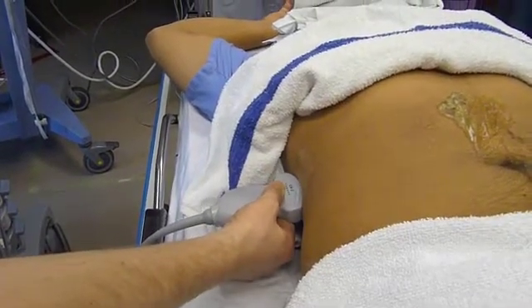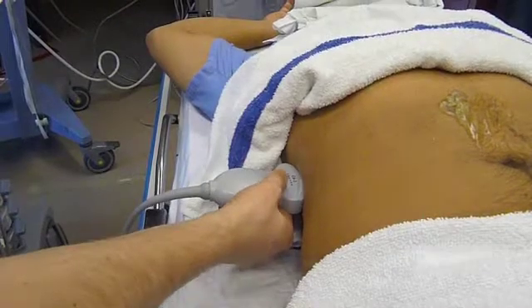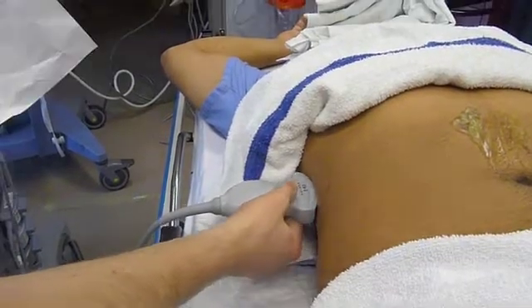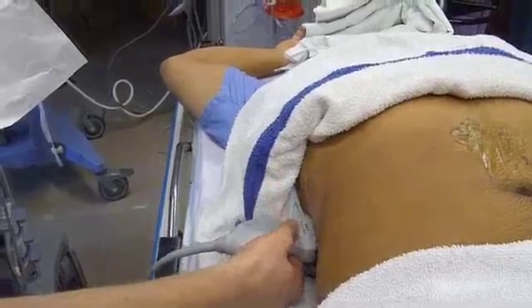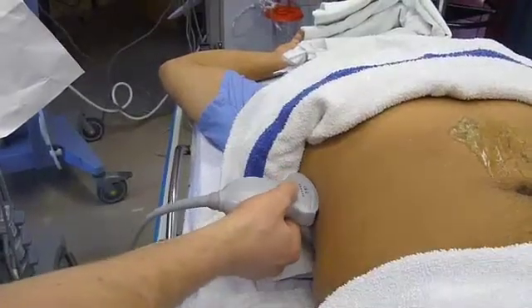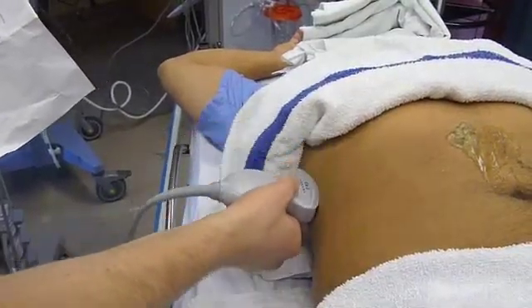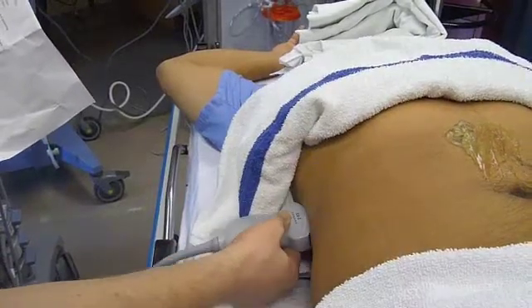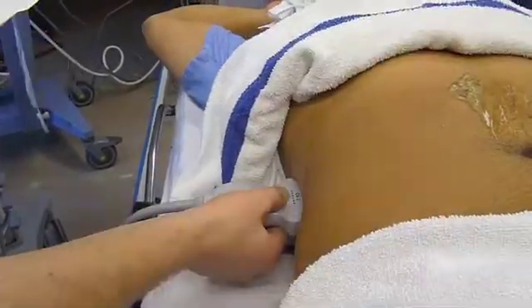Here I'm tilting it up slightly — that's not what you want. You want to be nice and parallel to the floor, just like I am right here. Another common mistake is allowing the probe to follow the curve of the patient's body. Practice keeping the probe nice and parallel to the floor.